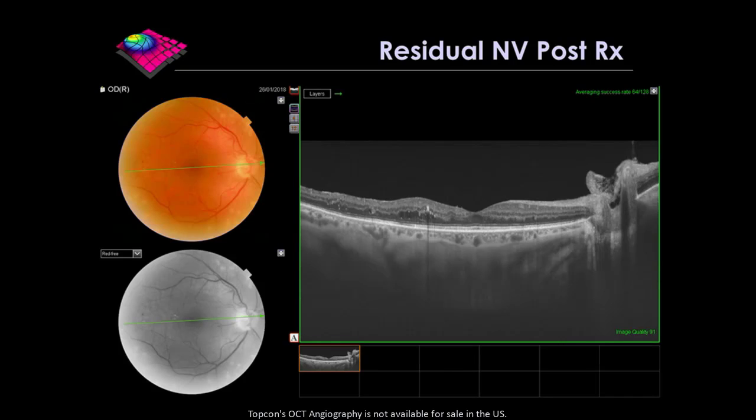And so what did we do with this patient? Well, they had 5 anti-VEGF injections into both eyes, and they had a lot of panretinal photocoagulation to both eyes. And so when were they last seen? Well, she comes back into us November 2017. Clinically, it looks much, much better, like a lot of it has regressed.